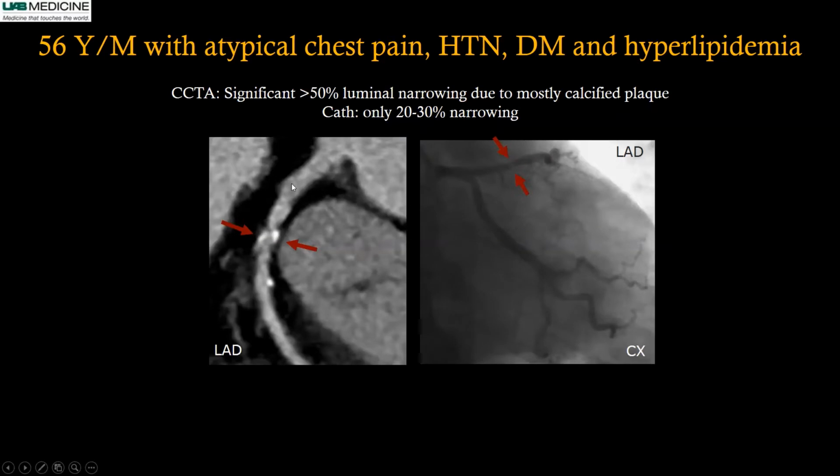And we did a coronary CTA. He was kind of a bigger guy, and his IV access was only 20 gauge. So we could not give more than 4 cc per second rate of injection. Ideally, it should be at least 5 cc. And what we saw was in the LAD, there was this plaque which was calcified, and the lumen looked quite narrowed.